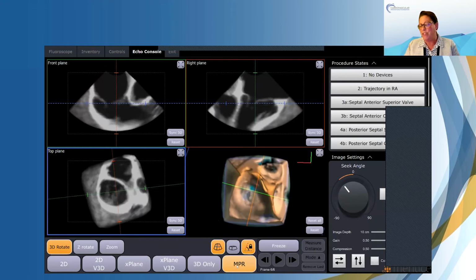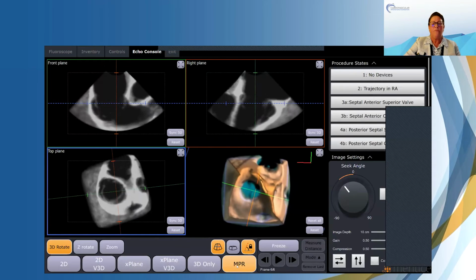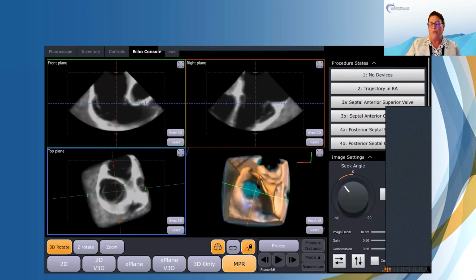Just wanted to remind us that we can use this to confirm how our catheter is sitting there. It's especially helpful in leaflet grasping. And as Dr. Singh said, this does take practice, and we're here to help you in any way we can. Thank you.